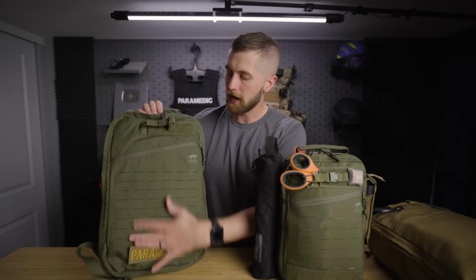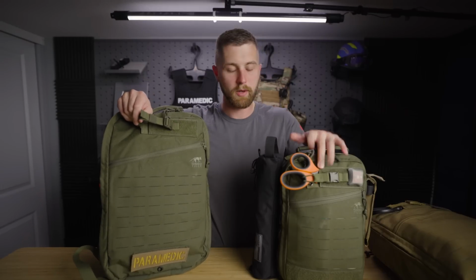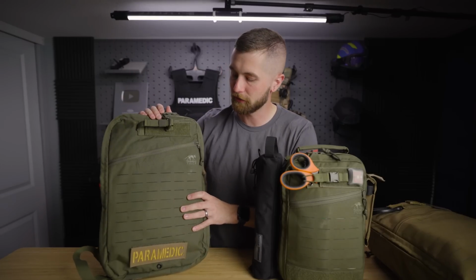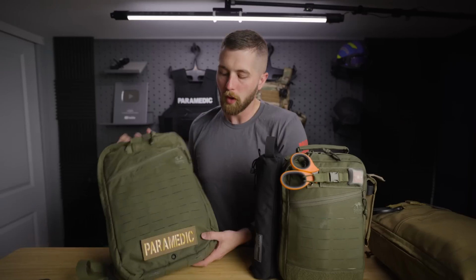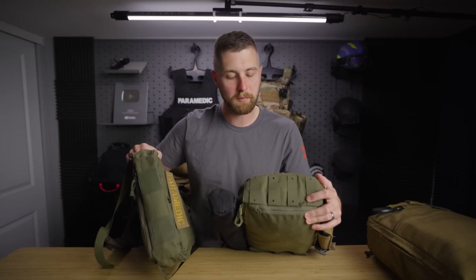So you'll see the design features on the front are the same. This guy right here, it's not the elastic loop like this one has for scissors, but you can still size it up, size it down. I don't think it makes a functional difference. You've got the MOLLE on the front and the Velcro patch down there. One thing I forgot to mention is on the bottom, this one's the only one, the small is the only one with MOLLE loops at the bottom.